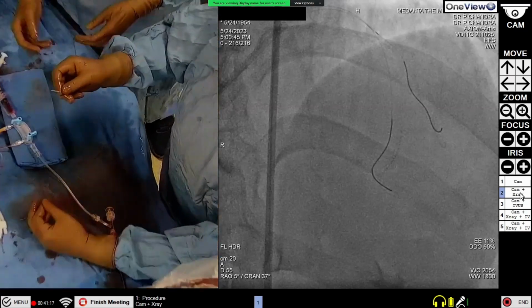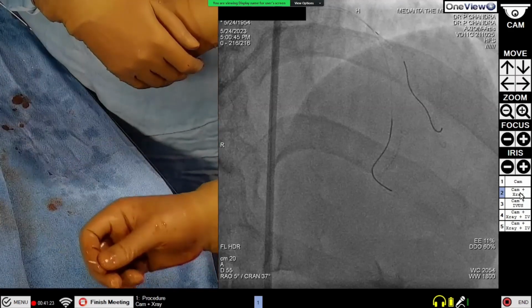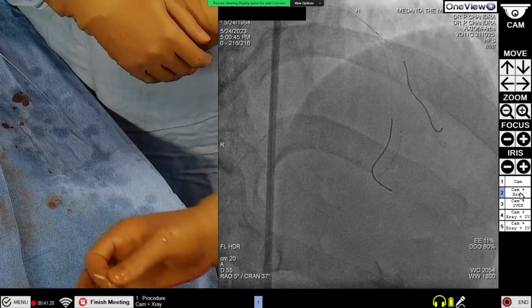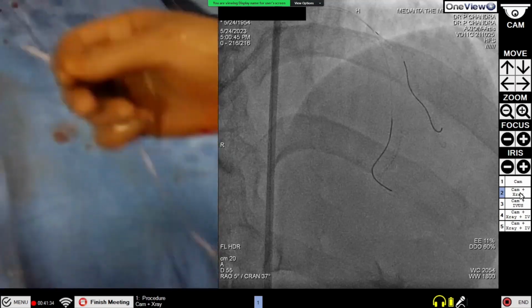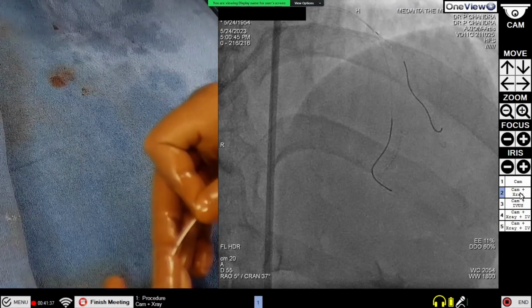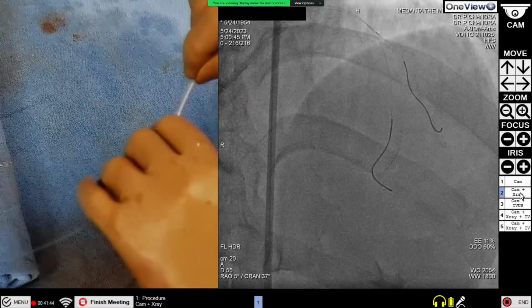And you can see this is a different technology. There is a difference between this technology and the paclitaxel eluting balloons, which sometimes are loaded on the balloon with the contrast. Then we have the other balloons which are with some polymer. And this is in small spheres in which the drug is loaded on the balloon.